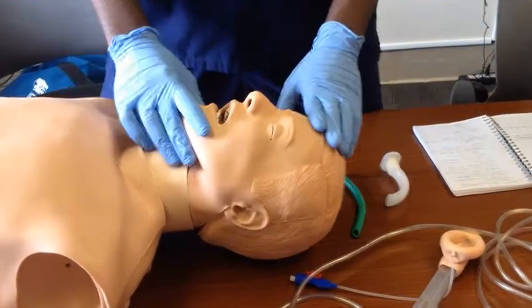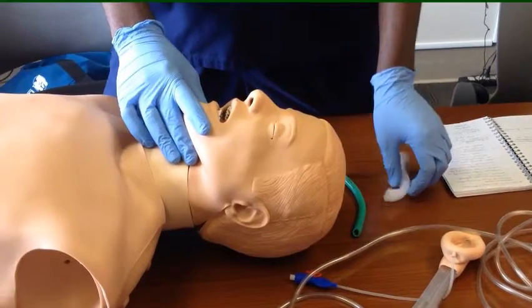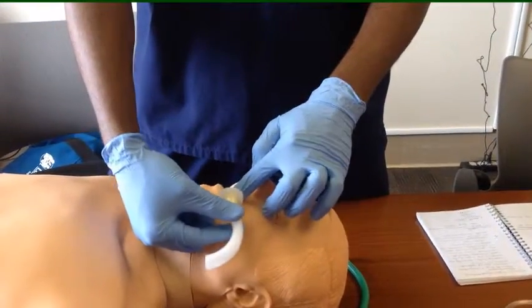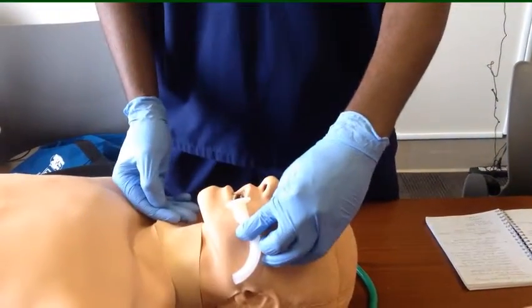We'll start by demonstrating how to use the oropharyngeal airway, the OPA, and this is how it looks. I'm measuring from the corner of the mouth to the edge of the jaw. It's the right size.